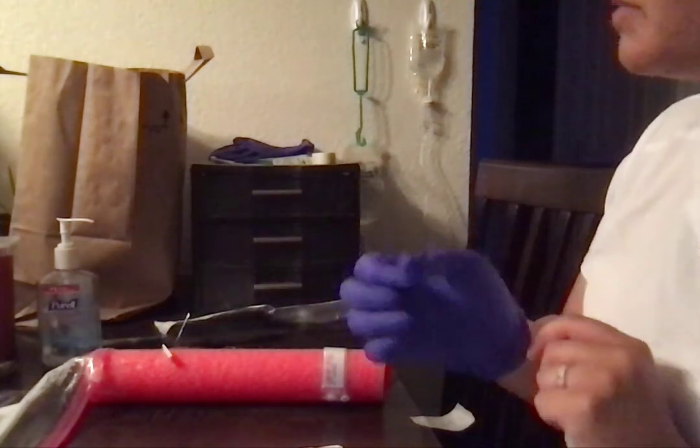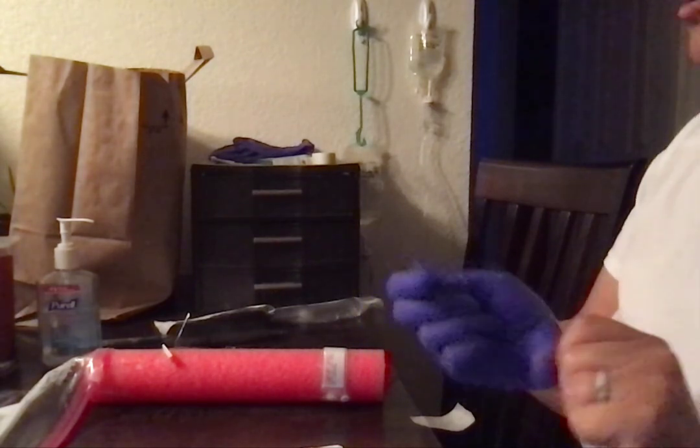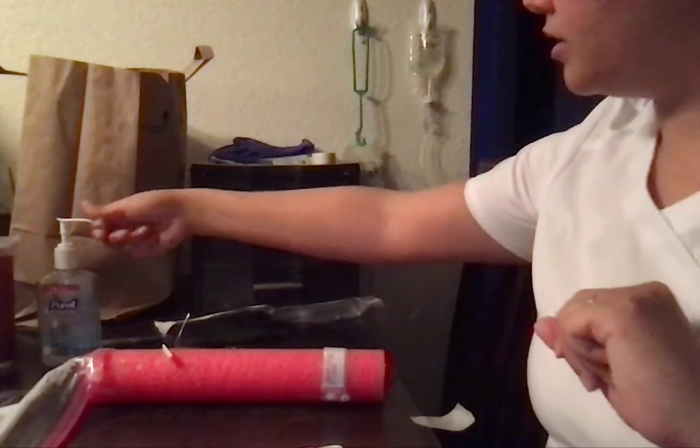Please let me know if the medication starts hurting you, if you have any pain or discomfort. And I'm going to go ahead and get rid of my trash and put my label on for when I started that. Leave her in a safe position. Make sure the call light is in reach, and if she has any questions, please give me a call. And now I'm going to go document in my MAR. Thank you.